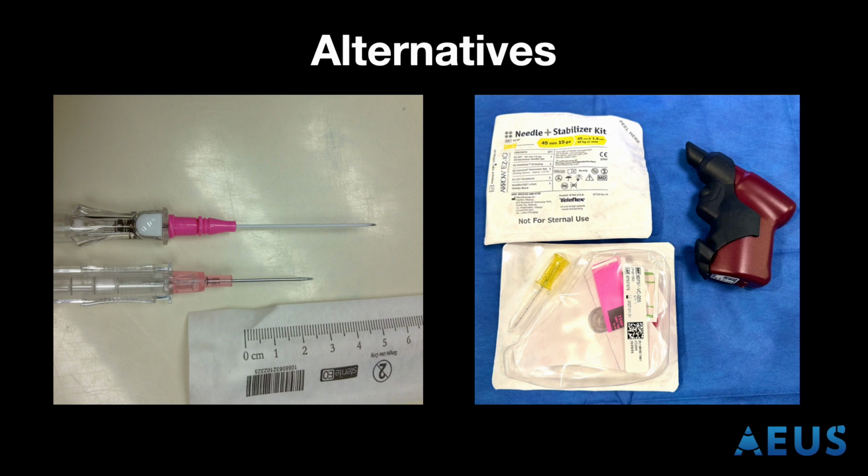There are several alternatives to central line placement, depending on the indication. Those include peripherally inserted ultrasound-guided IVs using longer catheters. These are used to access veins that are deeper or harder to find from a traditional landmark or palpation technique. IO can certainly be used, especially if your patient is coding or pericode, as a very quick alternative to central line access. And finally, depending on your institution, midline or peripherally inserted central catheters are a viable option if the indication is not emergent.